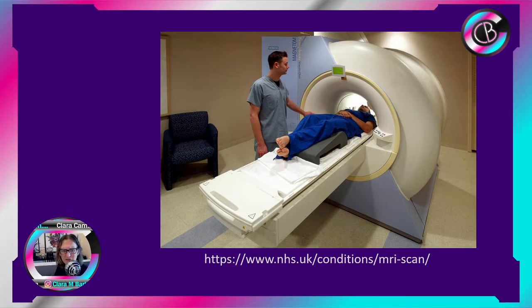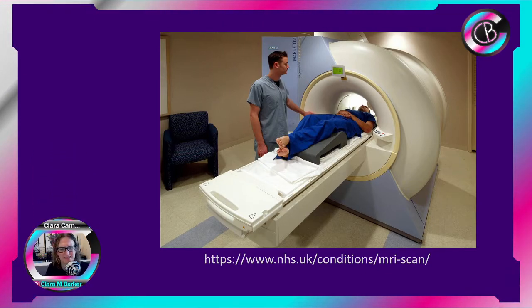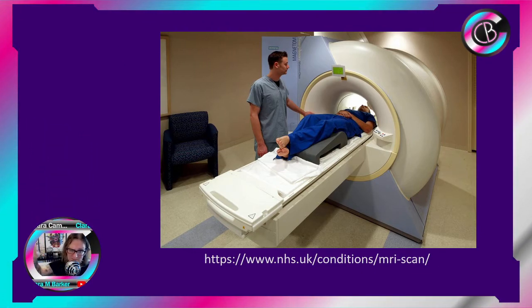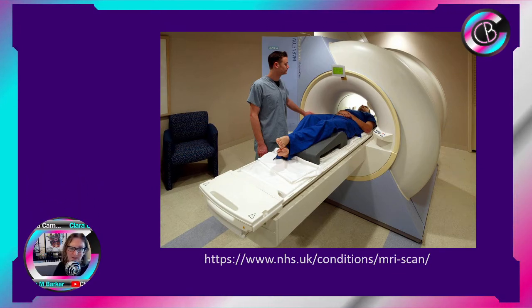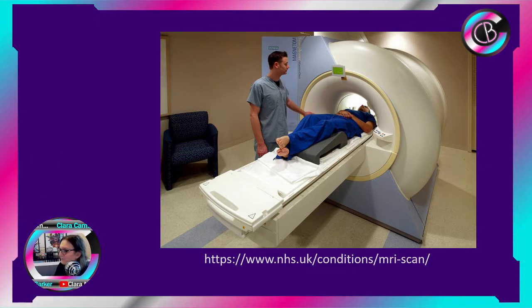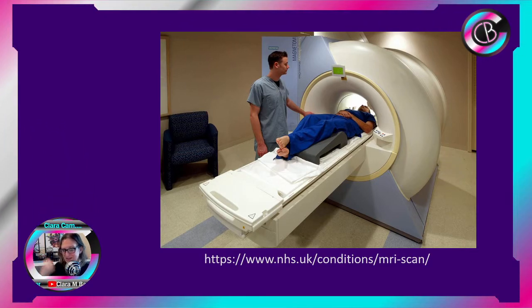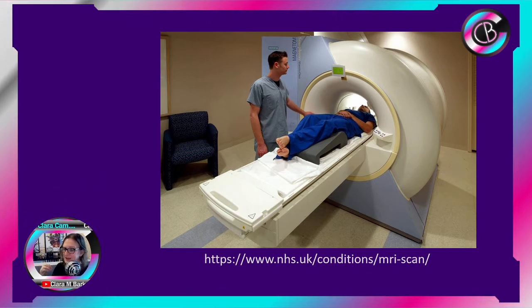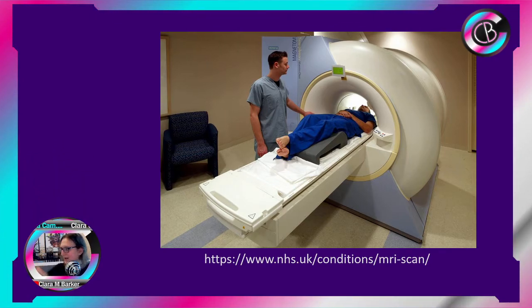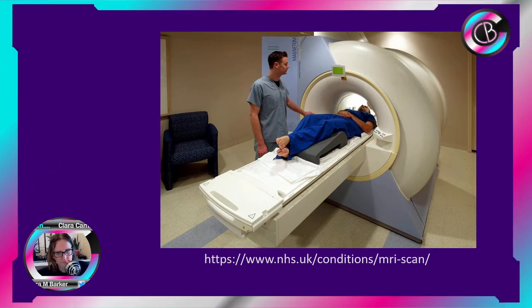We have a whole bunch of hydrogen, they're all spinning, they have this magnetic moment spin. We put them in, use the electromagnetic superconductor to line up the spins. Then we use RF to push them so that they're spinning at a different rotational angle than they necessarily want to be at. And then we remove that energy. We remove the RF, and energy is released as they gradually return to spinning at the circular angle that they want to spin at, and also in the right direction, because like I say, we actually cause some of them to spin upside down. And that is what we do.